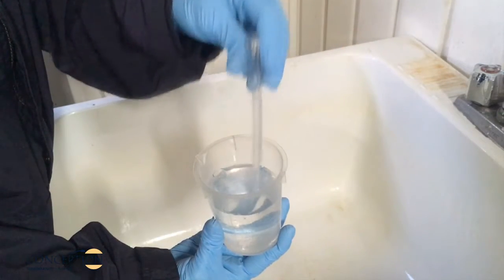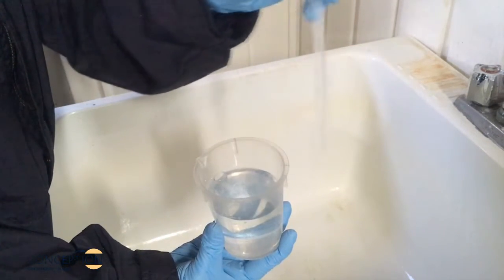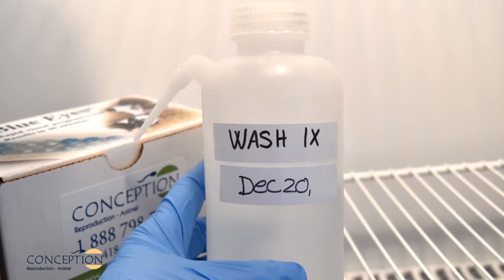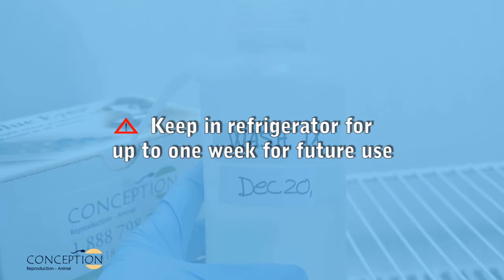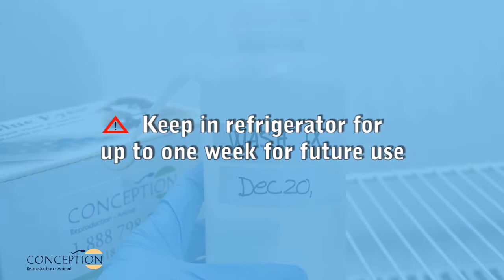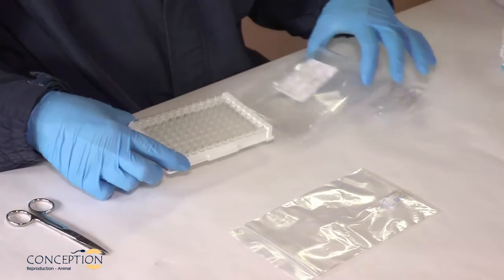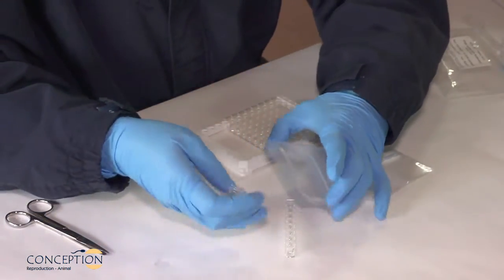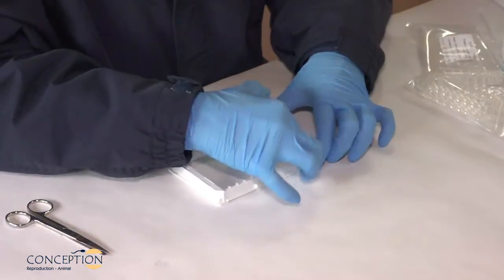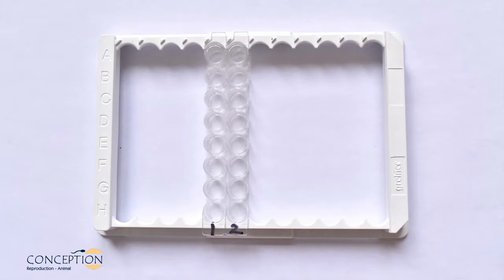Rinse the transfer pipette five times with clean water and store for later use. Unused washing solution 1X can be stored for up to a week in the refrigerator for future use. Use the number of strips required for the test and store unused strips in the refrigerator in the plastic bag with desiccant supplied for this purpose. Number each strip with a permanent marker.